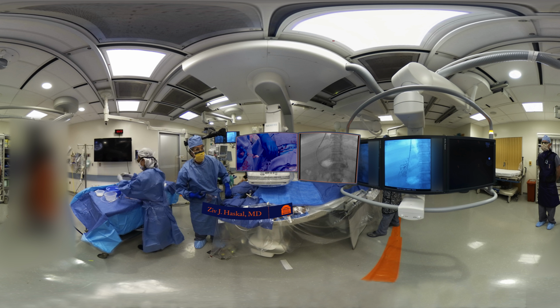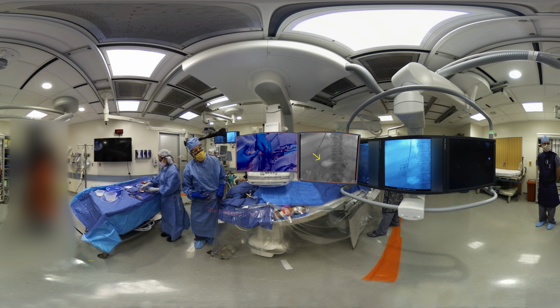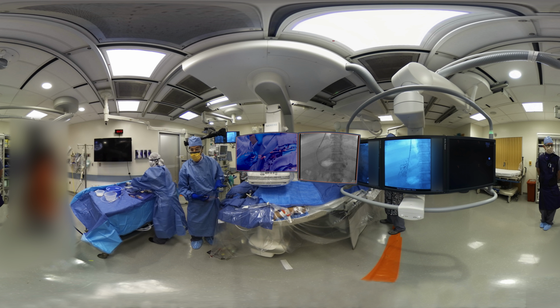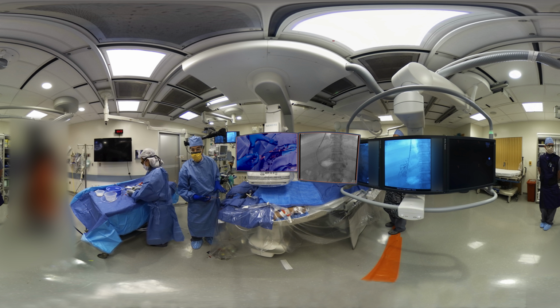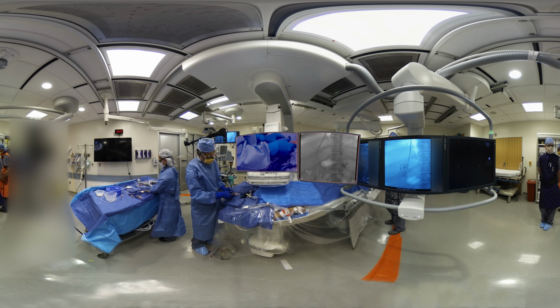There's relatively sluggish flow in the splenic vein. That first impression is important. You can see on screen that that was relatively stagnant. That's going to tell us something about the portal pressure and also our desire to move quickly. So this is a great sigh of relief in every case for anybody who does TIPS, because we are secured, we're across, and we've gotten through the first several events, and now we kind of see the end in sight.